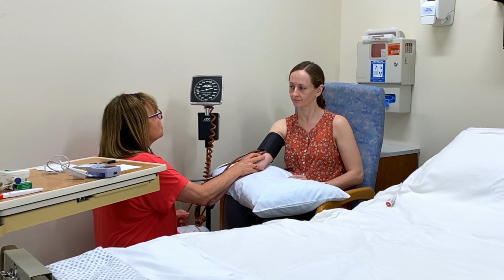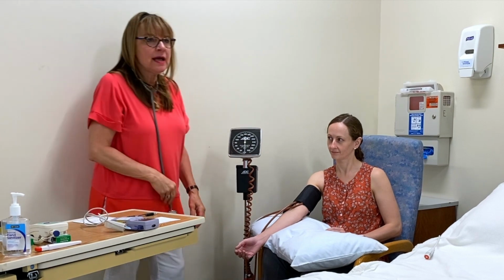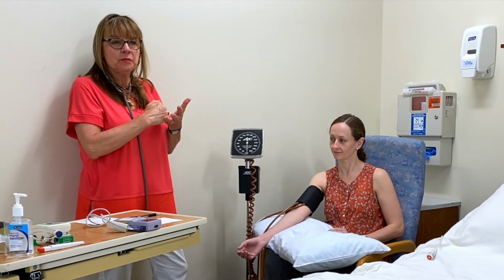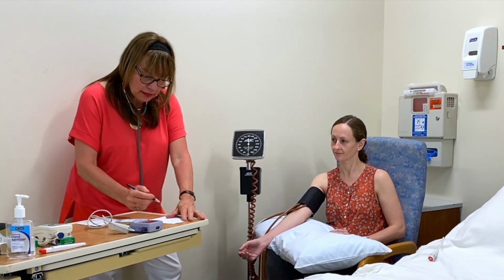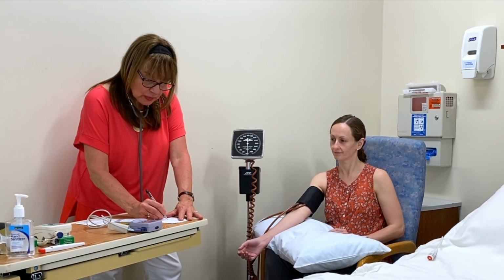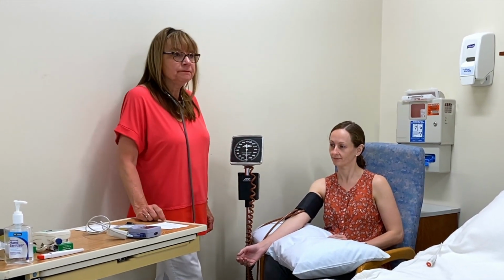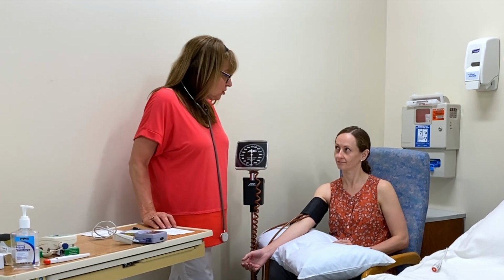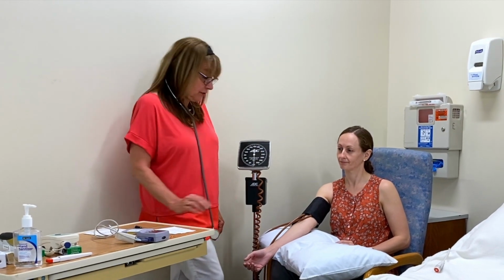102 over 74. So the first sound I heard was 102, loud pulsation, thump thump. And the last sound, the diastole, was 74. Now the new standard, according to the American Heart Association, is that everybody's blood pressure on the planet that is an adult should be under 120 over 80. It used to be a little higher, but that's the new standard.